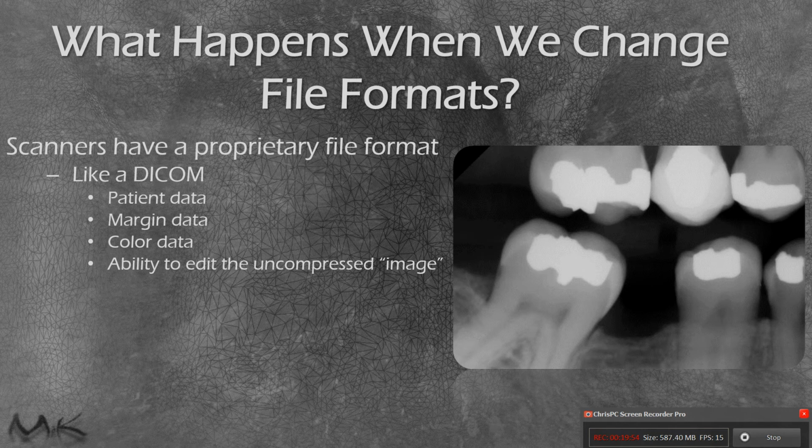What an STL file makes us lose is patient data, margin data, color data, and the ability to edit the uncompressed image. So editing an STL file sometimes can be a little bit more challenging than editing it in our actual design software. So to me, that's one of the easiest ways to explain it.